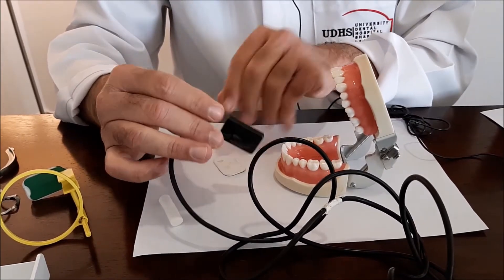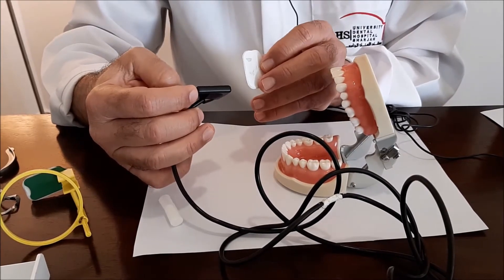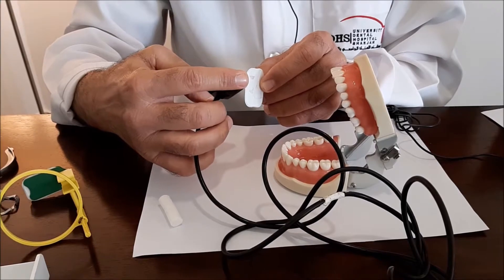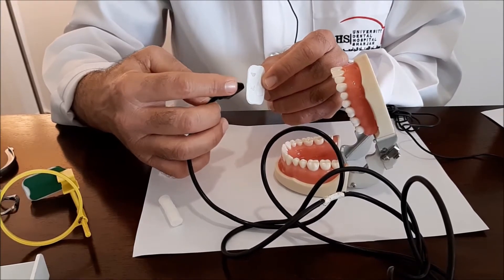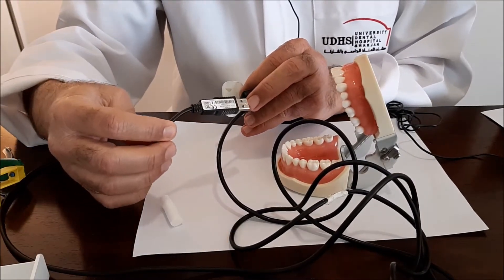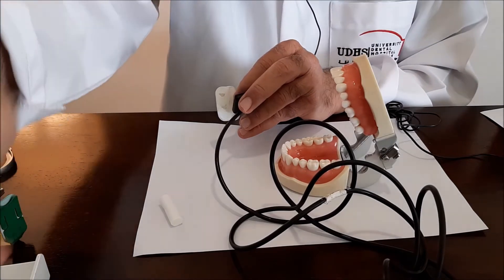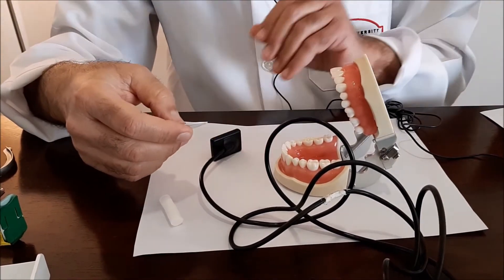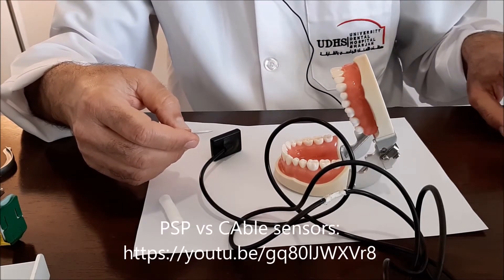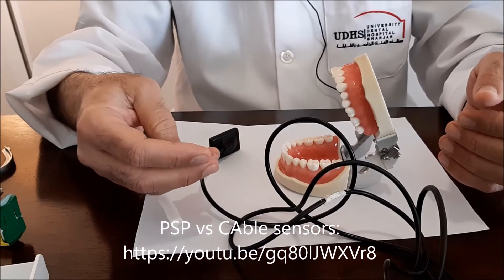These direct sensors tend to be thick and they lack flexibility. Those PSP plates are thin and more accepted by the patient. However, the PSP will need a scanner to process the images. The direct sensor will be connected directly via USB to a computer and the image will be processed readily with no delays. I have made videos to show you the difference between the PSP plates and the direct sensors in terms of the pros and cons of each.